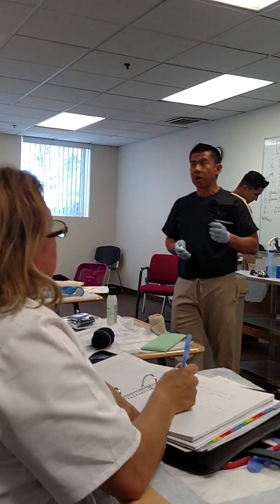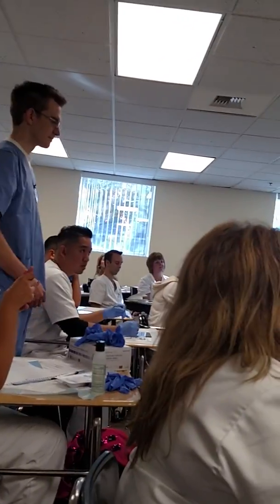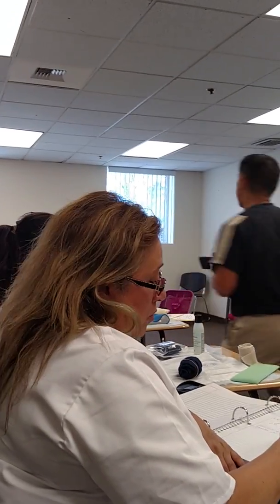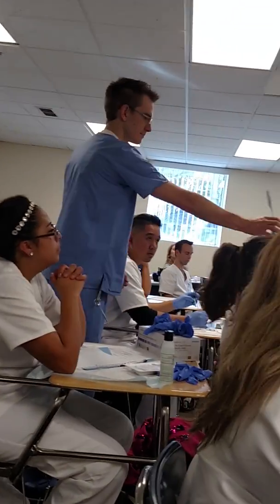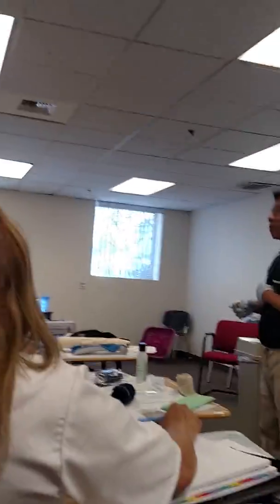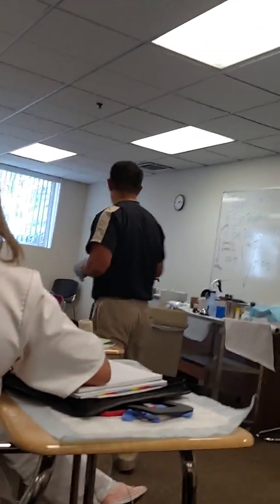So Eric, my name is Leonard. I'm your medical assistant today. I'm going to check your vision. Are you ready? Yes. Alrighty. Eric, I'm going to have you hold this occluder. Now, Eric, is that prescription glasses? Okay, so we'll check your eyes first with no prescription. Would you please remove your prescription glasses?